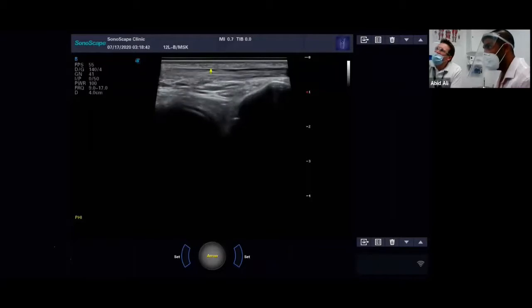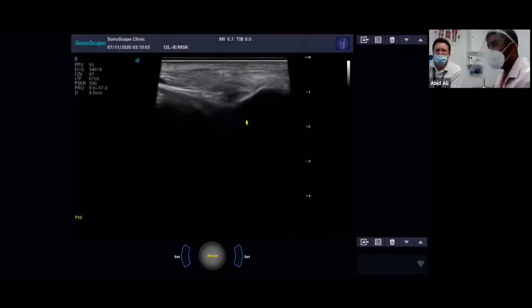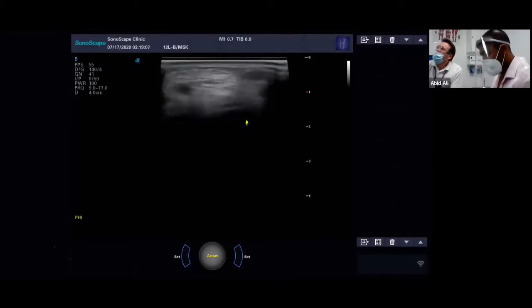So, of course, if we are injecting tendons, it's that sheath, that layer that you want to get into. You don't want to go into the body of the tendon. You want to go into this layer sheath. So doing ultrasound-guided paratenon injections is really nice and simple with ultrasound. Okay, so what we're going to do now is move our probe from the longitudinal plane to the transverse plane. We're going to start on the medial side.